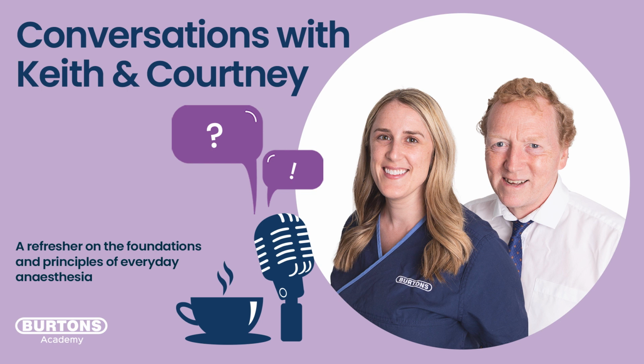By setting our inspiratory time to 1 second and the volume to 155 mils, we've dictated what the flow is, and the machine will deliver that flow until it's delivered the whole 155 mils. Once the volume has been completely delivered to the patient, it stops. That's volume cycling. You determine what volume will be delivered, and the machine will do everything it can to deliver that volume.